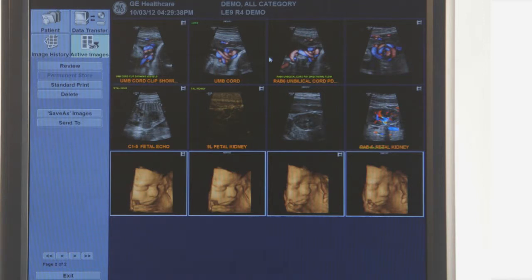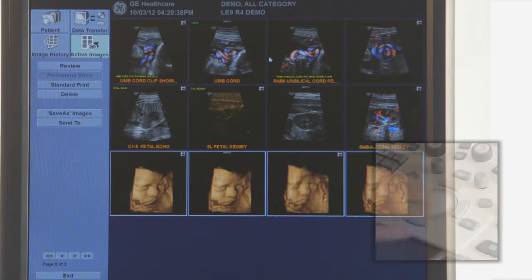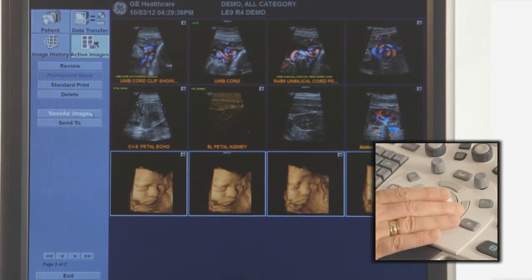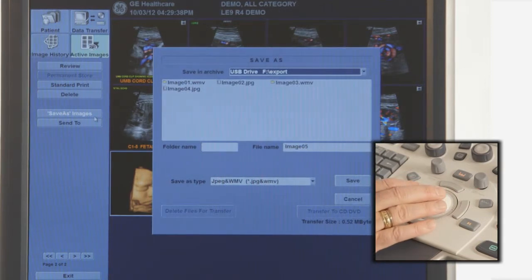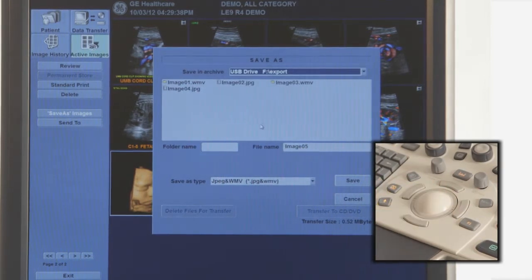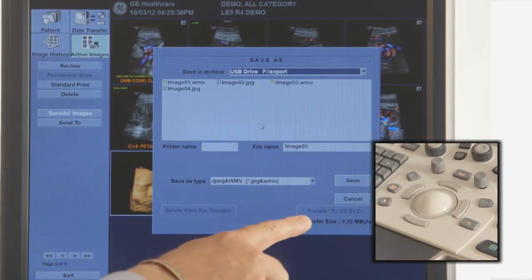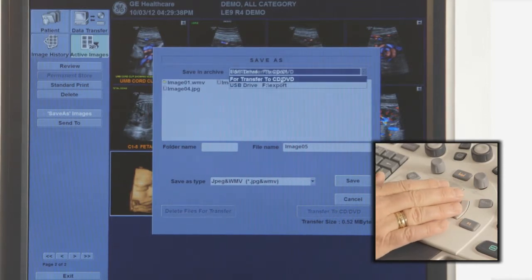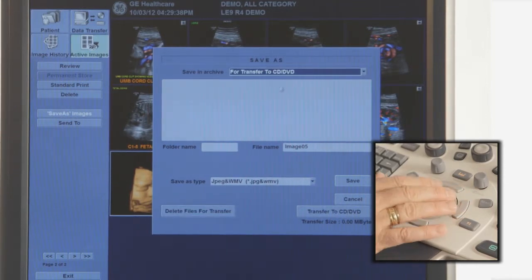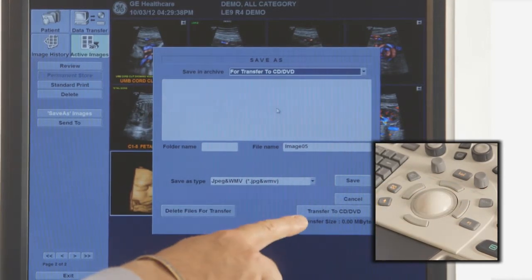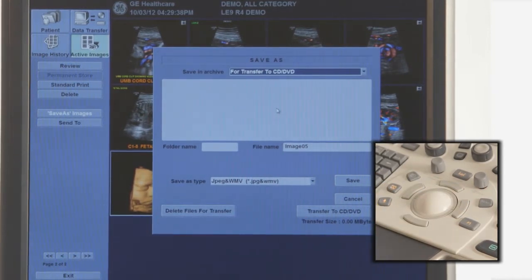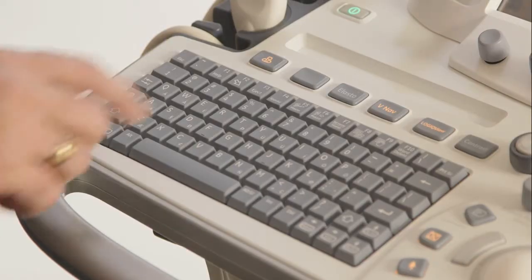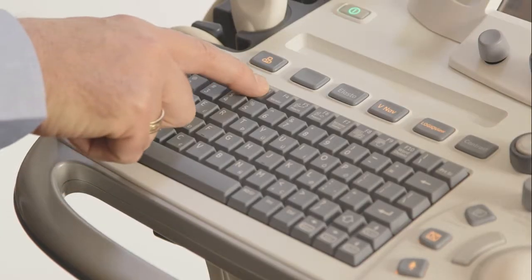If saving to a disk, select Save As Images once more from the left side of the active image page. This time, select Transfer to CD/DVD. The system will self-format the disk and copy the images. Finally, eject using the F3 key and finalize the disk.